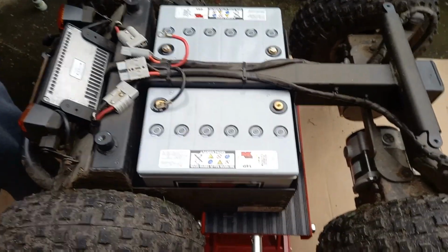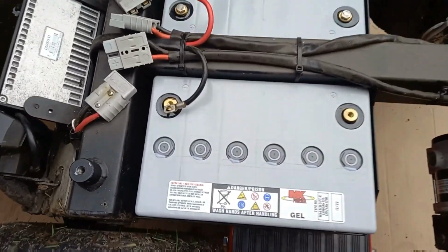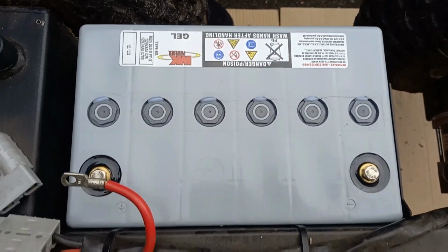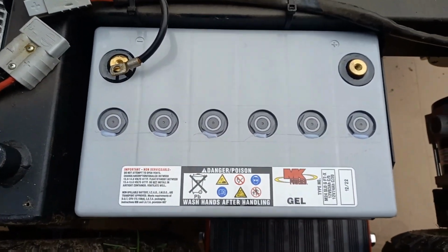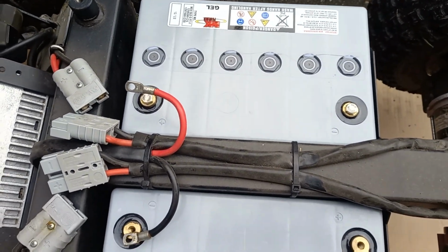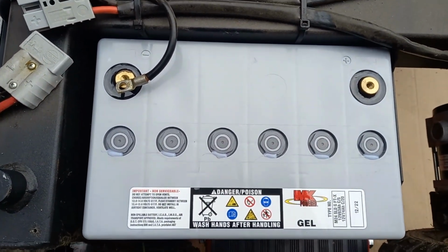So new batteries are safely in. That was really hard because there's no room to lift them. You can't get your fingers in, and they're 25 kilograms each. That was the hardest, most awkward thing I think I've ever done. Very tricky. You have to put them in at a very slight angle to start with as well, otherwise they don't really want to go in.